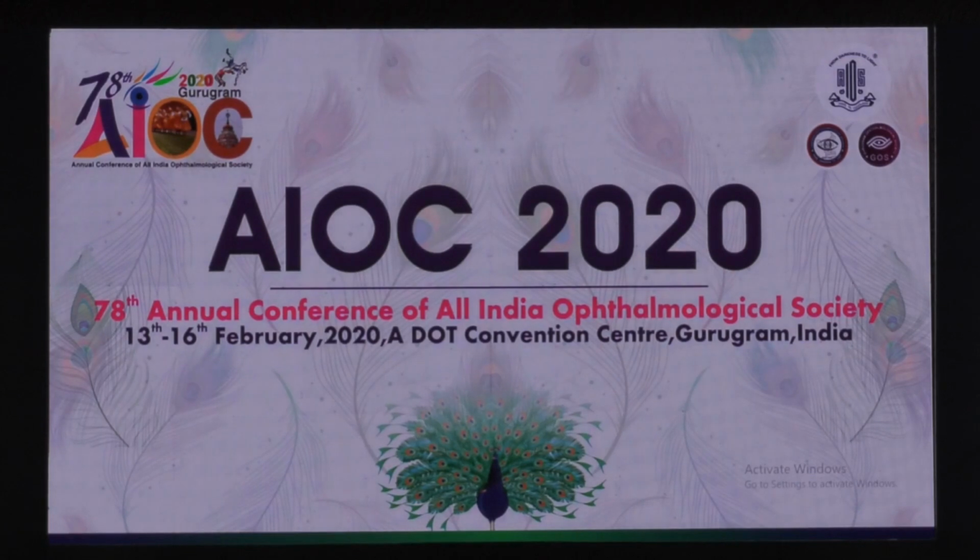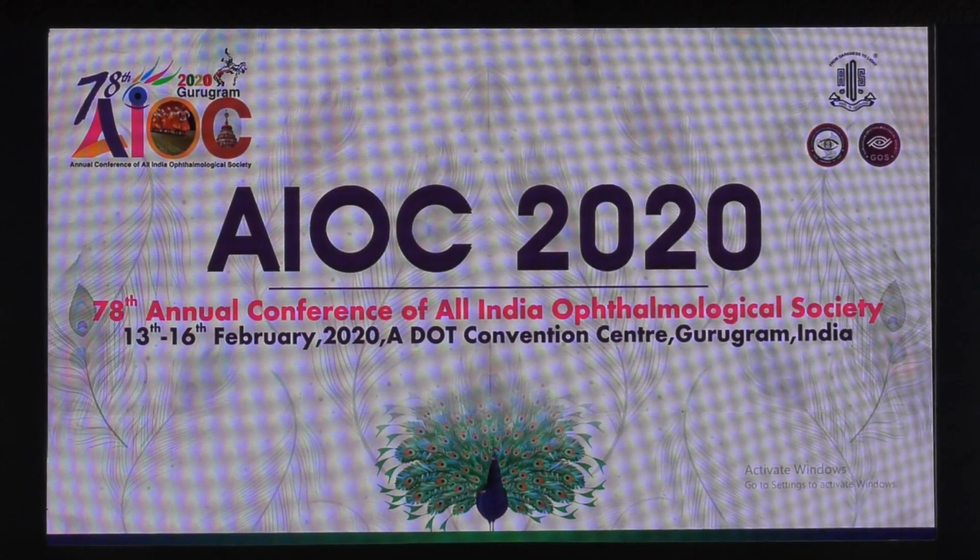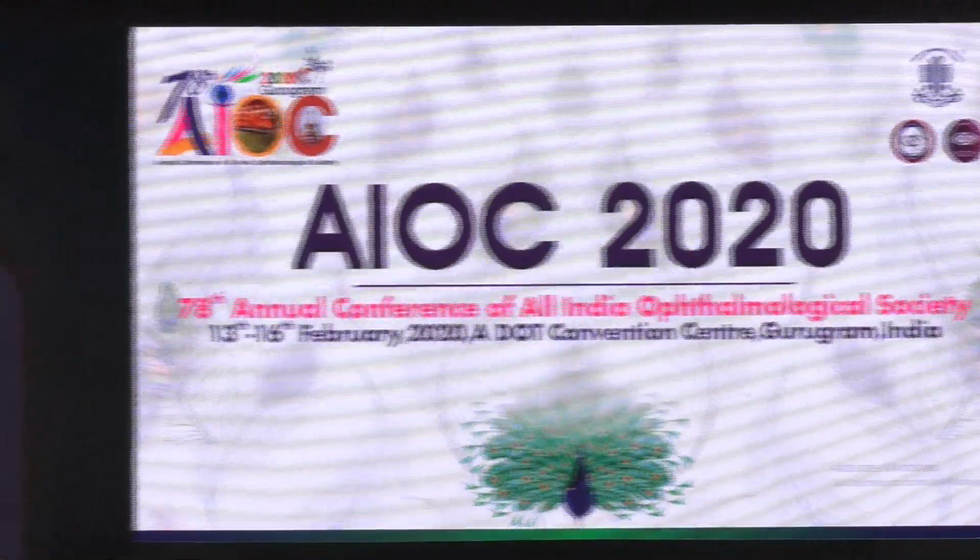Thank you, Dr. Sumita, for the excellent talk. There is nothing more to add, nothing more to delete, but only a little summary: if a vertical field or a quadrantanopic field defect is associated with low vision which is not explainable, out of proportion to the visual loss, then you think of a neurological condition. Very straight.